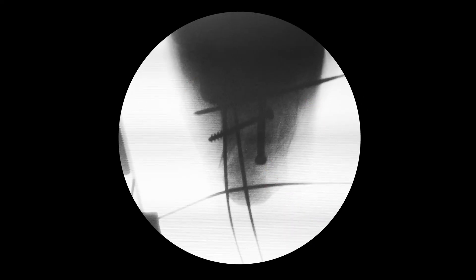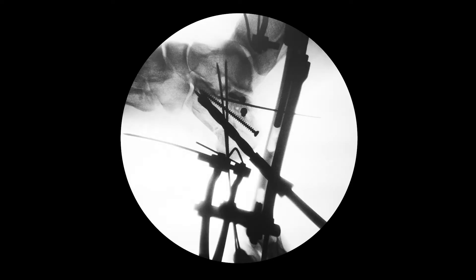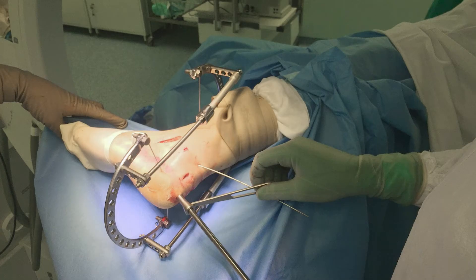Thus an additional longitudinal screw was required. For this nail design, a guide wire was correctly installed along the axis of the calcaneus with image intensifier control, and reaming along this wire with a cannulated drill bit was performed.